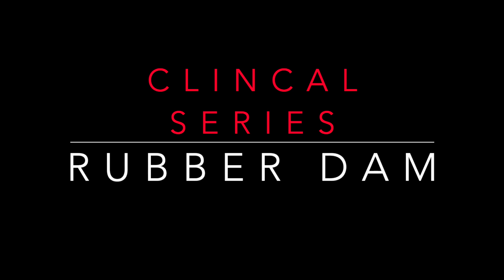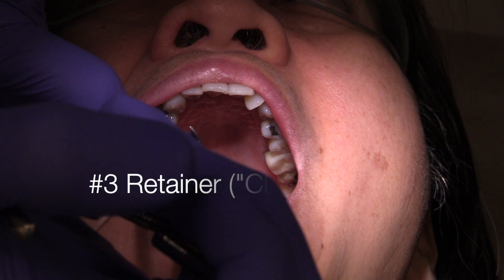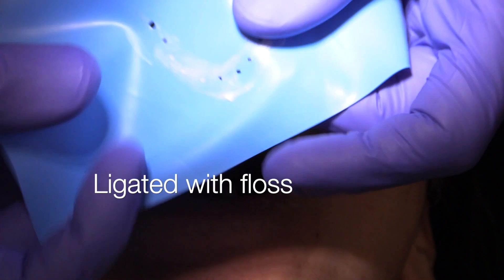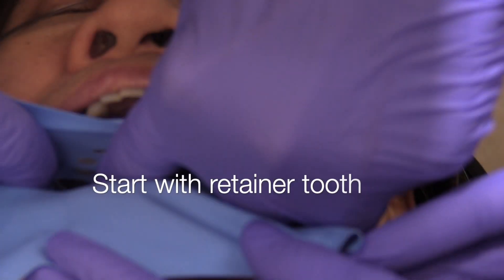Today we're going to be discussing the rubber dam placement. Our patient today, Edward, is going to be receiving a couple of inlays on teeth numbers four and five, but we're placing a number three retainer on tooth number three.